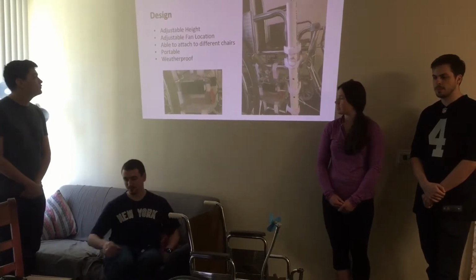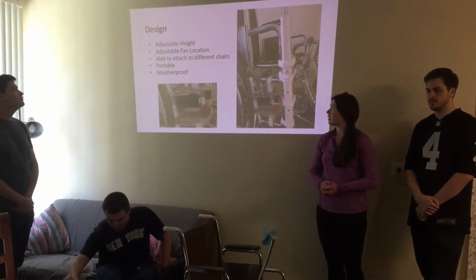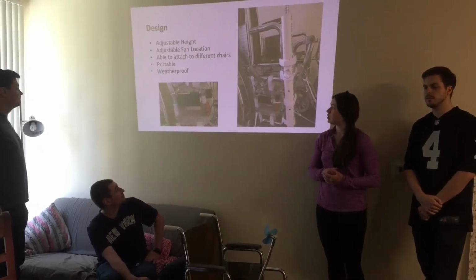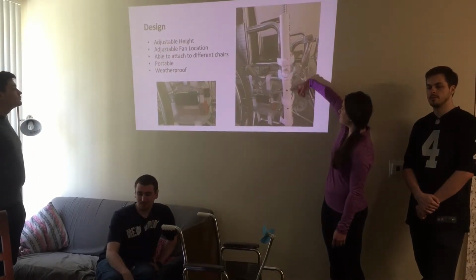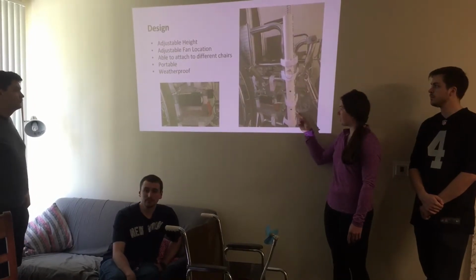So next we're going to look at the design of our mechanism. We wanted to make sure that this is a very adjustable device that it can hook up to many different chairs. So first we looked at making it an adjustable height, and so we used two PVC pipes inside of each other, and there's a pin so that you can adjust to 3 different heights.